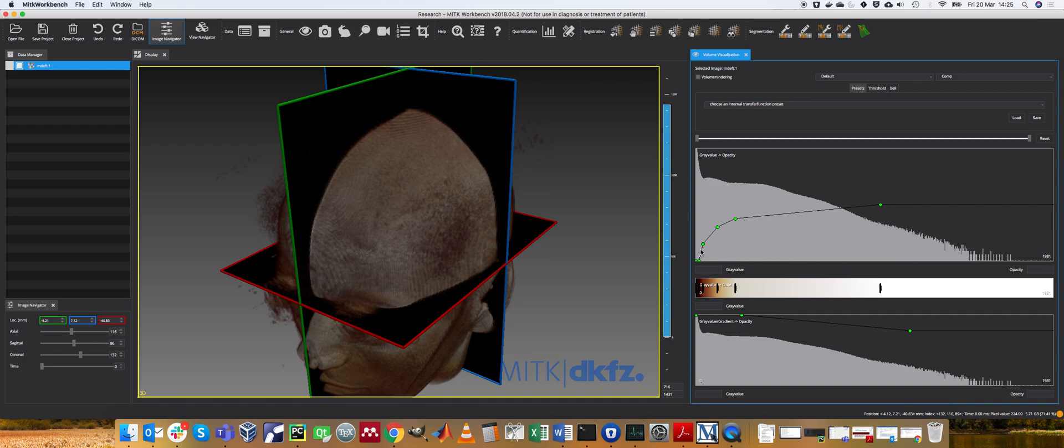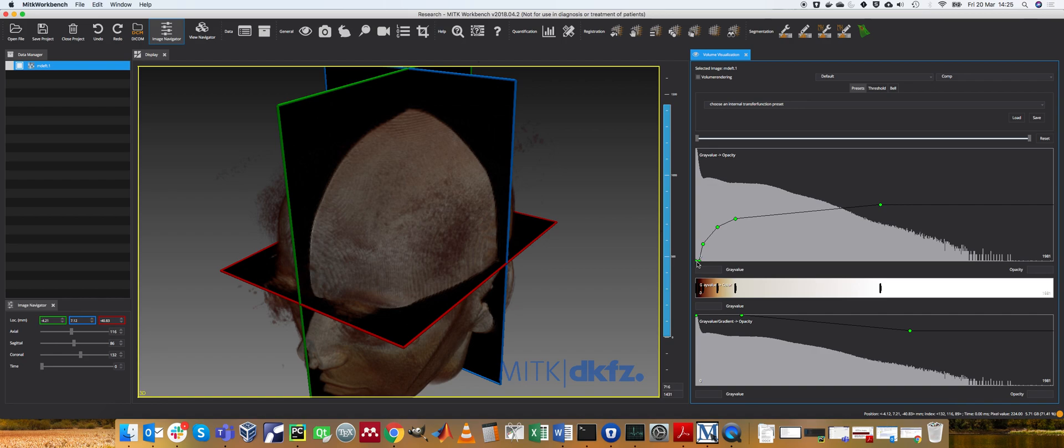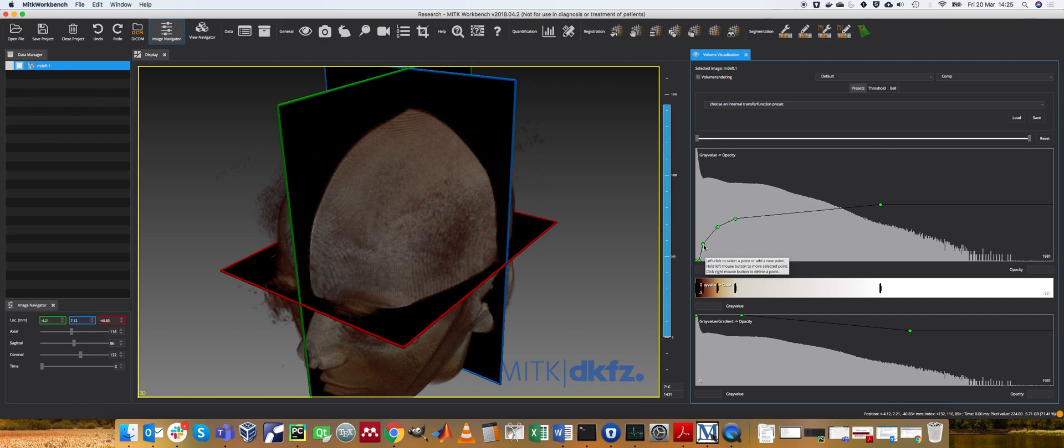On the y-axis we have opacity and then we have this function drawn here by defining some landmark points. As you progress along your ray, you pick up the value of the voxel data and look in this graph, and you map the image intensity to an opacity.